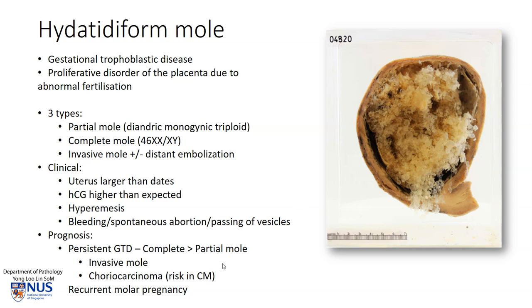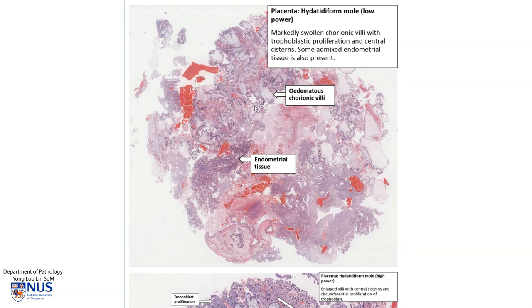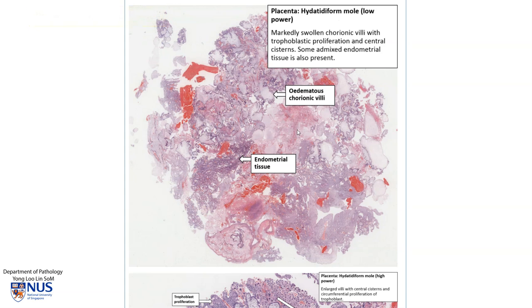Let's move on to have a look at the microscopic appearance. These pictures are obtained from PathWeb, the online pathology resource. We're looking here at some material from a hydatidiform mole. If you focus on this area, we can see very markedly swollen chorionic villi. The bluish areas around the villi are evidence of trophoblastic proliferation.